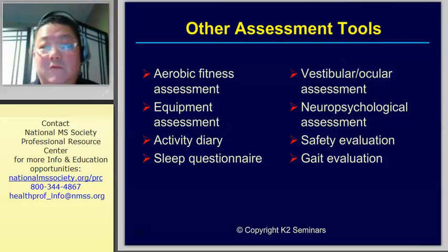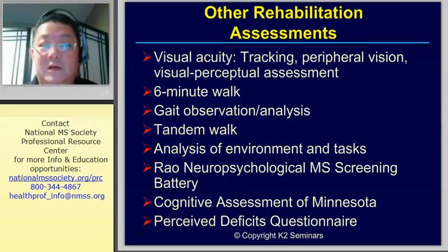A lot of times I will videotape the patient up front to get a baseline so that I can actually see and compare down the line. In gait, you can address just one piece of the puzzle and get a phenomenal outcome. So if you're dealing with spasticity, for example, in the ankle, reducing that spasticity using electrical stimulation, suddenly you have a gait pattern that's much improved, decreasing the balance limitations, improving their function.